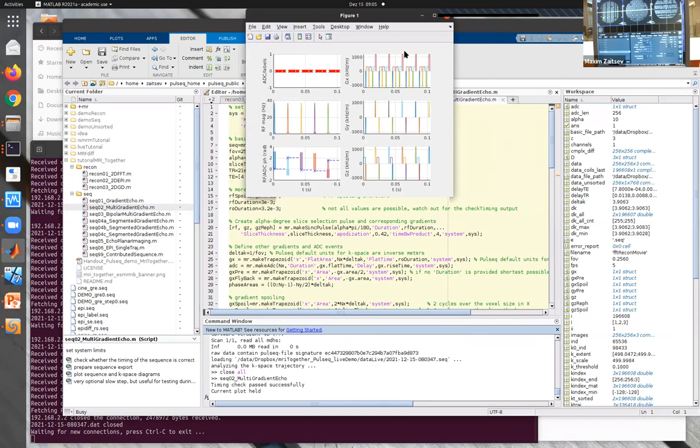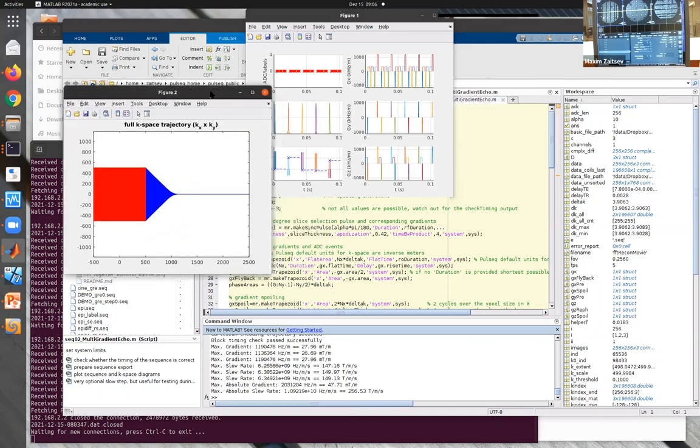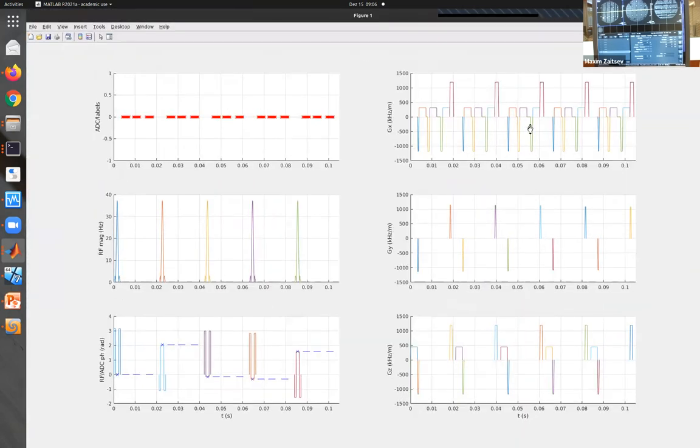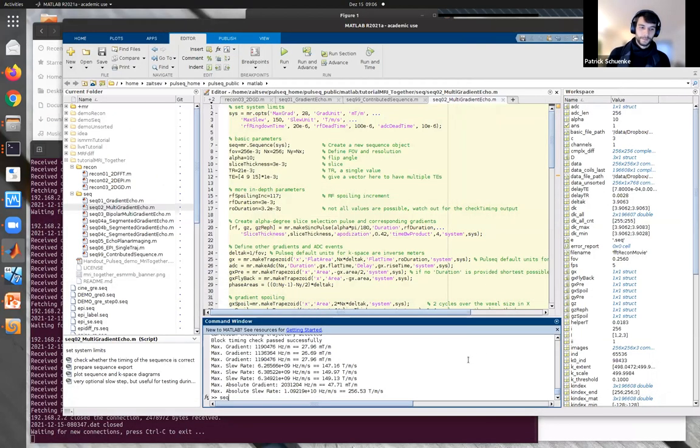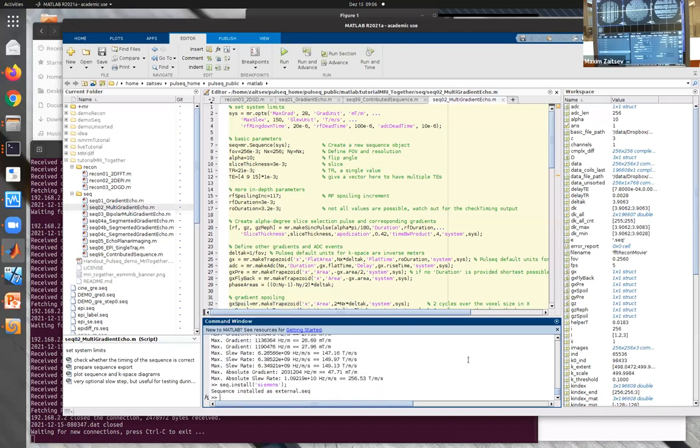Let's have a look. You see already on the plot that a single excitation is followed by three gradient echo readouts with very powerful, very quick flyback gradients. I can make this window bigger. Do you see it now, right? I hope you do. Yep. And we can do sequence install. And we can run it.